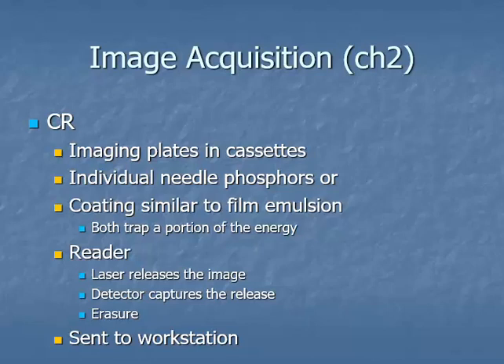Otherwise, the laser stimulates those phosphors, and because of the divergence of the light field from the laser, as it pivots, on one end of the plate you would have a larger light field stimulating more phosphors, and it will give you an uneven density across the image. So light focusing optics, pivoting laser, and fast scan while the imaging plate travels through the reader on a slow scan.